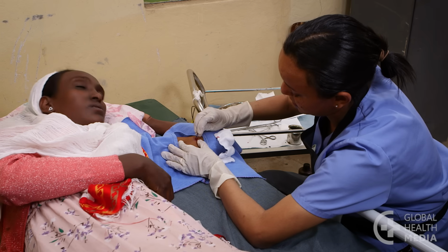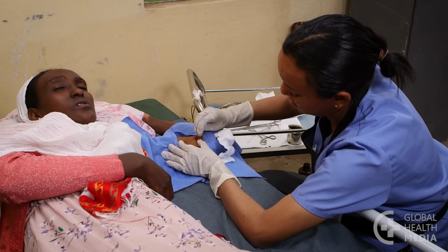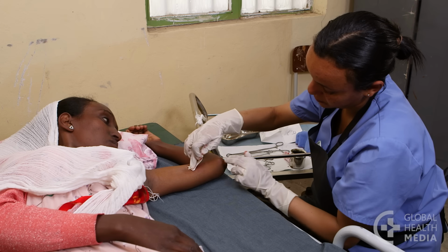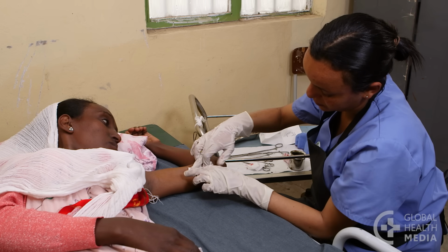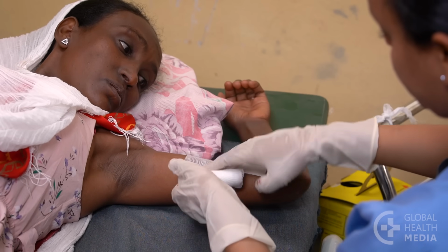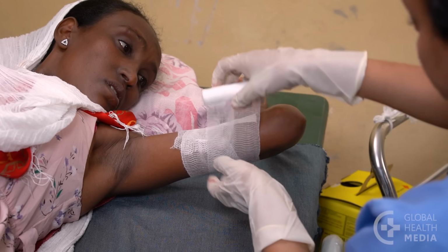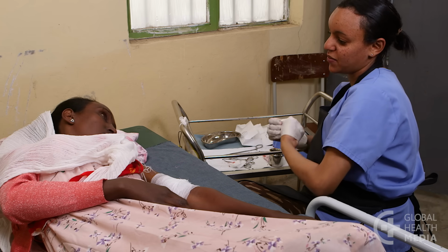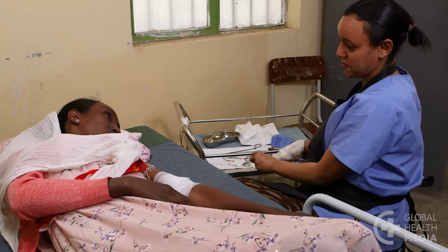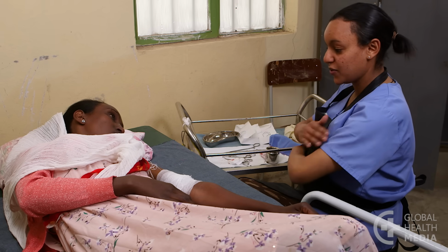If you are not able to remove an implant within 30 minutes, stop, cover the incision, and apply a bandage. Have the woman return when the incision is fully healed in 4 to 6 weeks to try again. If you have removed 1 of 2 rods, advise her to use condoms or not to have sex until she returns.